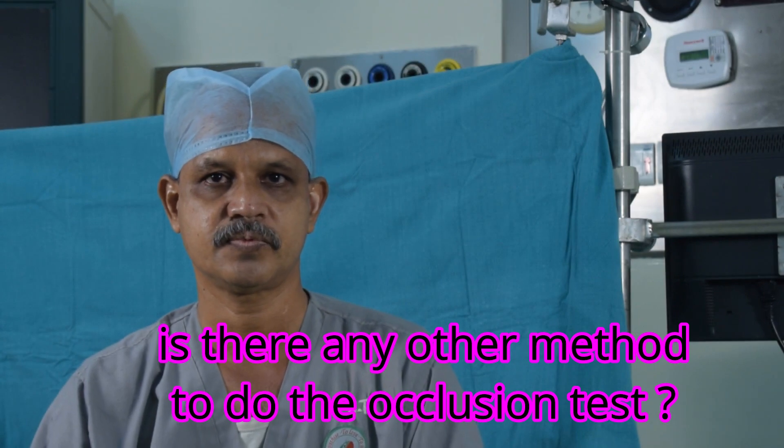Is there any other method? Yes, the third method is the pressure fall method, and this is done while the rollers are stopped. The circuit is primed as usual and a pressure line is required. After de-airing the circuit, you clamp the outlet line and build the pressure to about 300 to 350 millimeters of mercury. As it reaches 300 to 350, you stop the pump and watch if the pressure is falling at the rate of 20 millimeters of mercury per minute. If that is so, then it is normal occlusion.